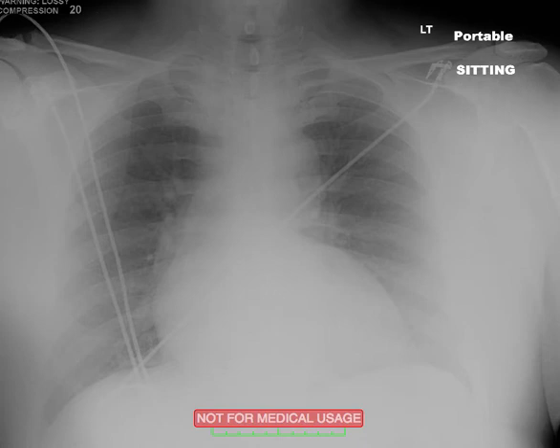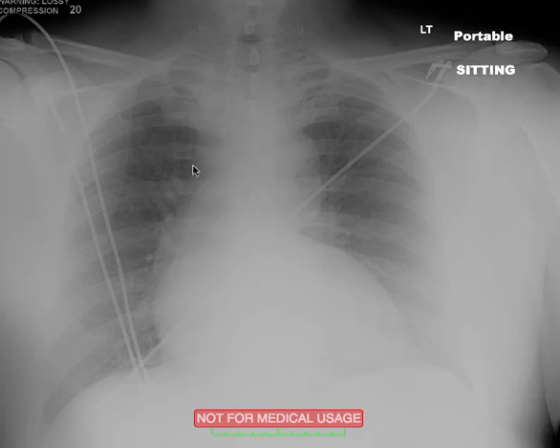This is Dr. Mintz. I wanted to go over chest radiography. This is a portable chest, AP portable chest, and just a brief commentary about how to approach these.